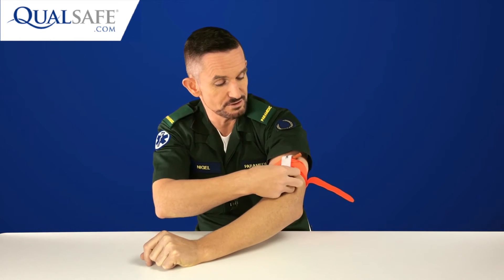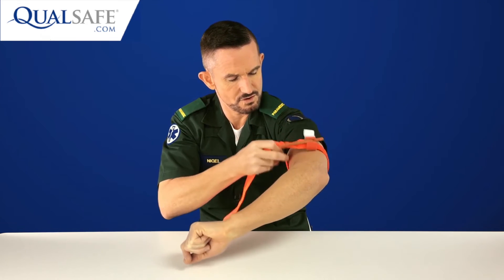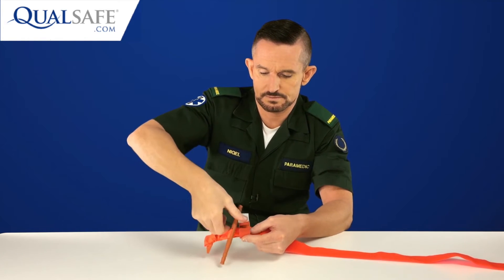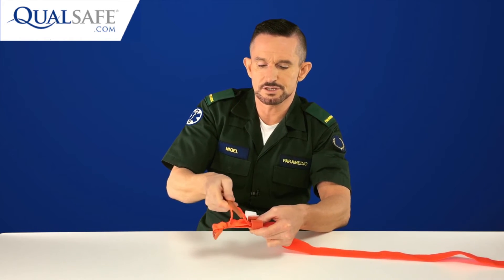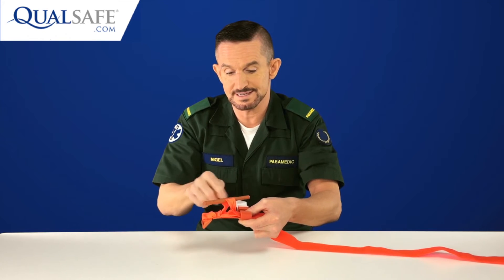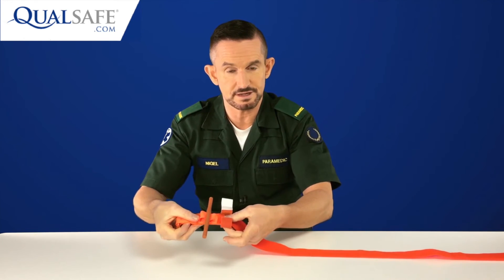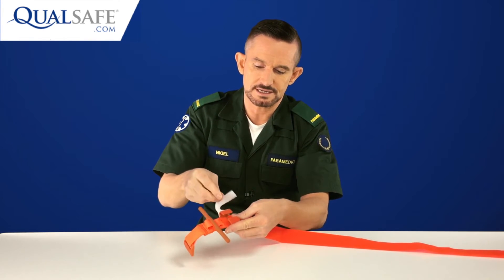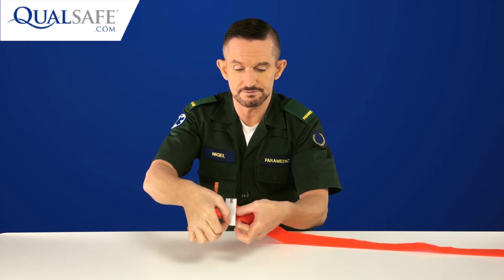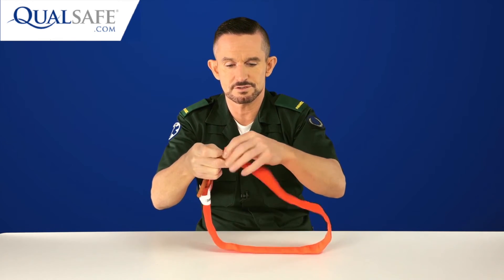For the classroom, I'm going to take this off and show you something. When you undo the windlass, you can see I've pulled quite a loop of material. Before the next person practices with this tourniquet, we need to get it flat again — just hold it at either end and pull it flat. Then touch the white strap's velcro end down to keep it tidy, and that's how it should be stored ready for use and ready for your next student.